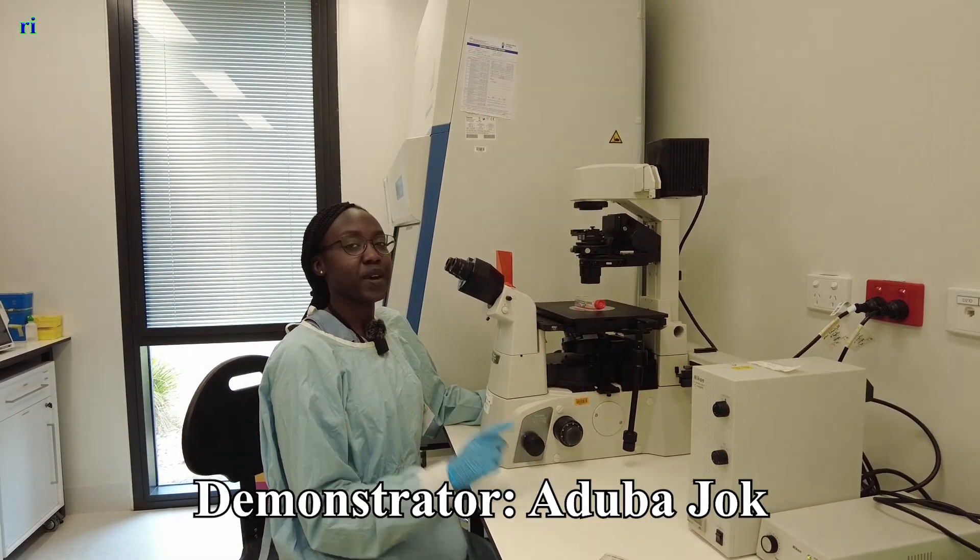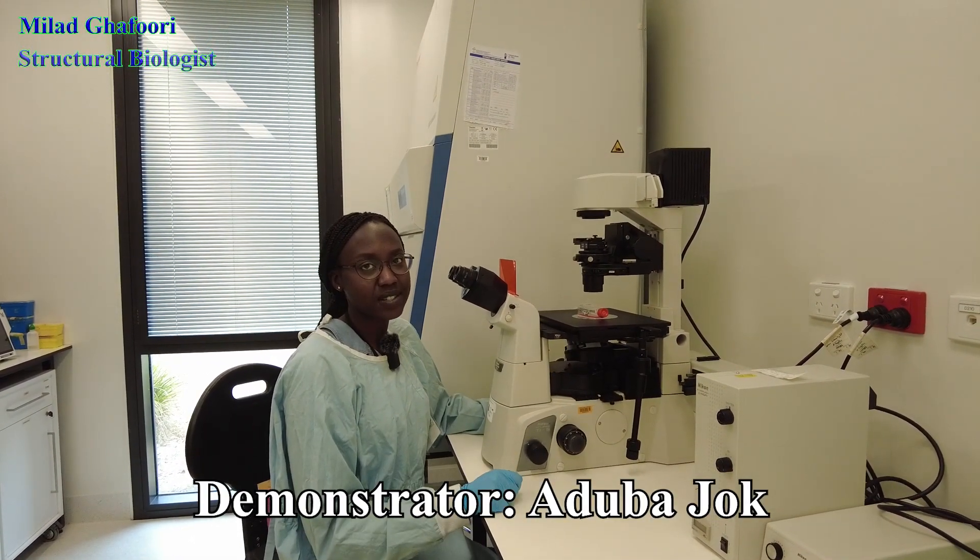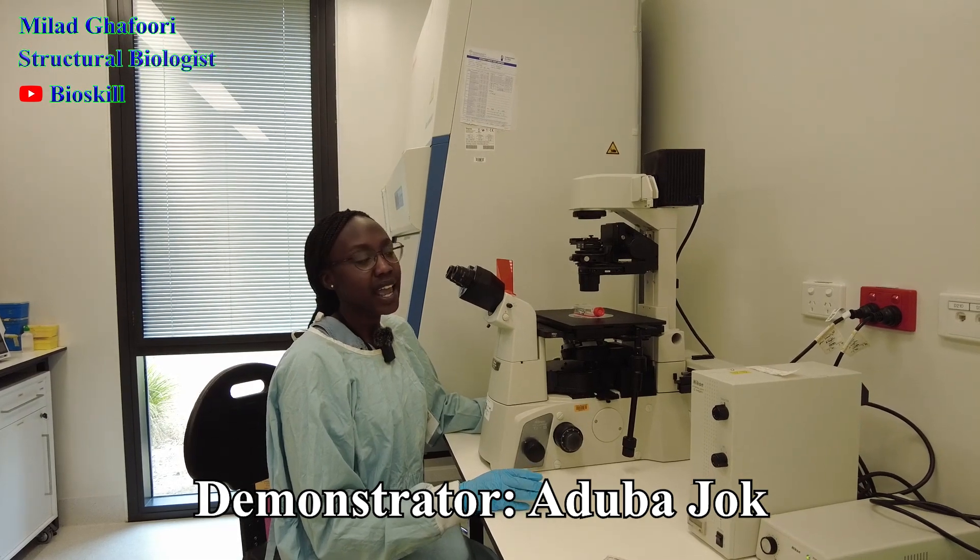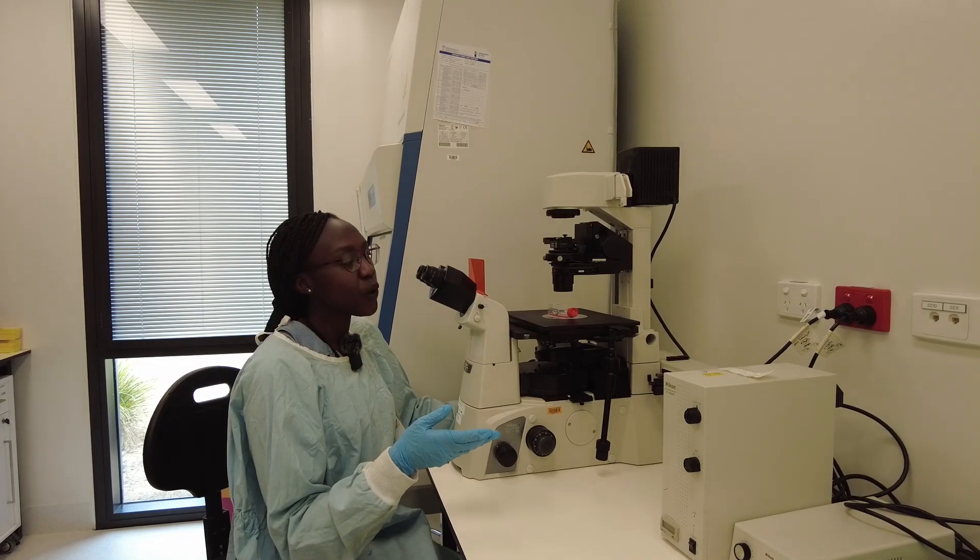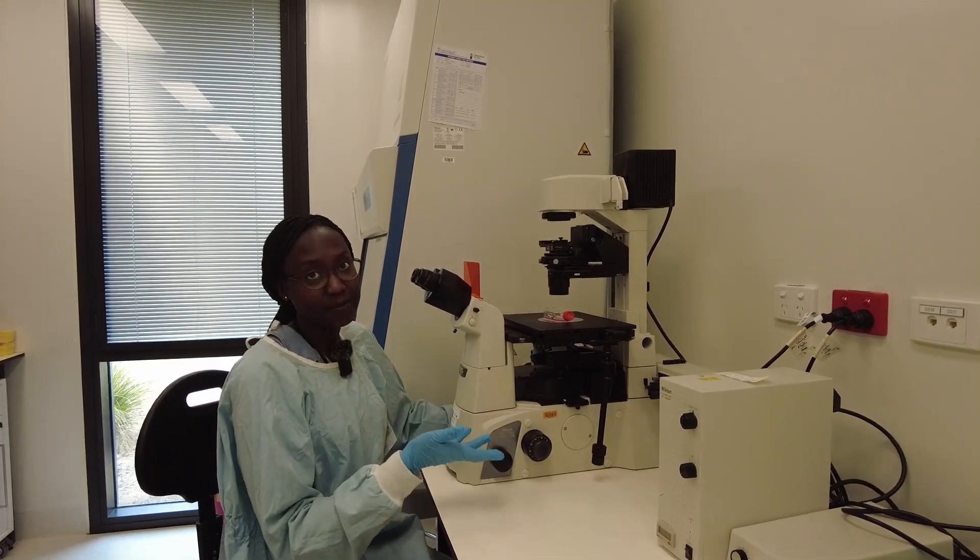So now we're going to look under the microscope at our small T25 flask for normal colon cells and we're going to determine whether or not it's ready to be split into another flask or if we need to continue growing it in the same flask.